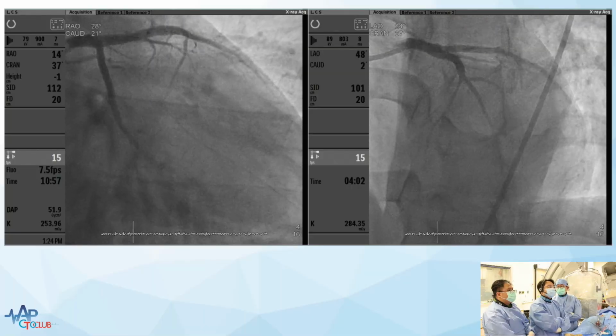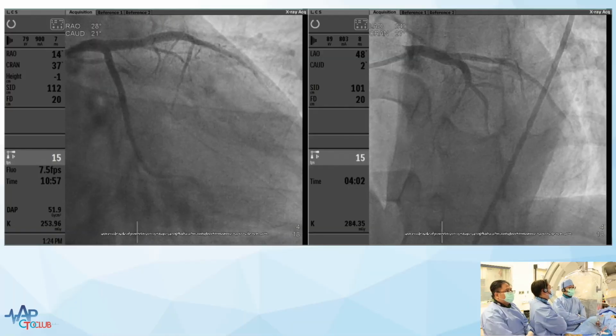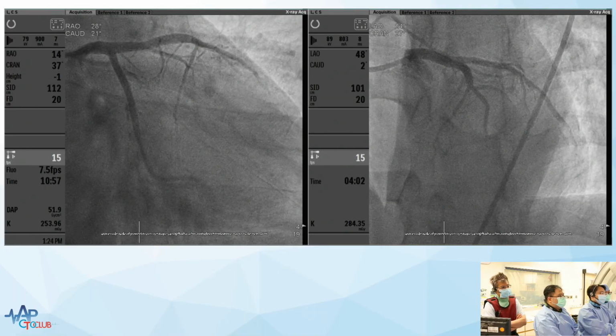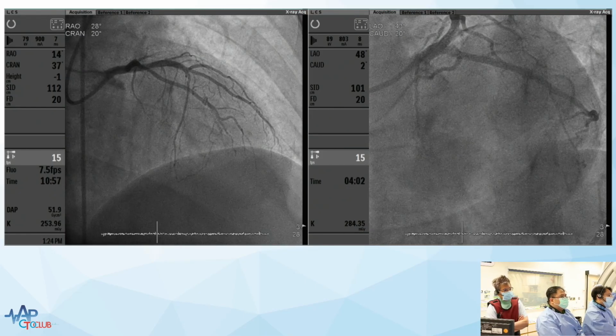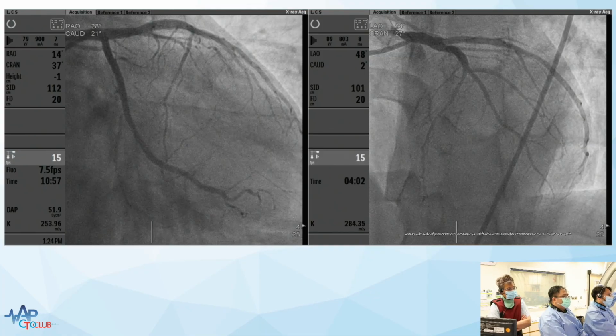Do we have a CT scan of this patient? Yeah, this is important, just in case, do you have a CT scan? No, he did not come with a CT scan, I think. Okay, it would be very, very helpful. We're just looking at the pictures that you're playing at the moment, and we're just debating whether there's some antegrade channel, whether it be bridging or micro channel, or whether it's just overlap. If you play the angiogram, the previous one. Yeah, maybe the IVUS should be placed into the septal instead of the diagonal, because with a CT scan we can realize the LAO cranial route.